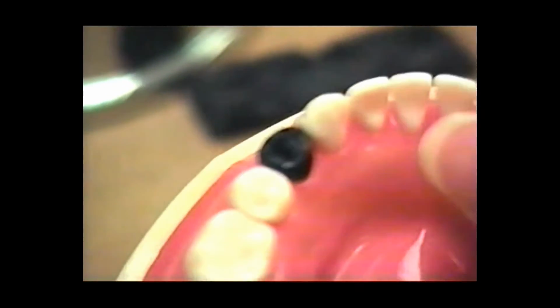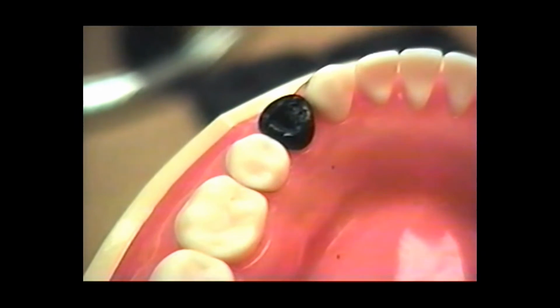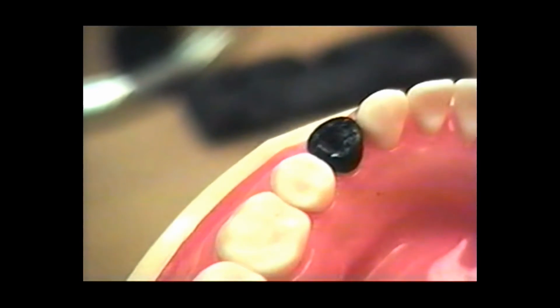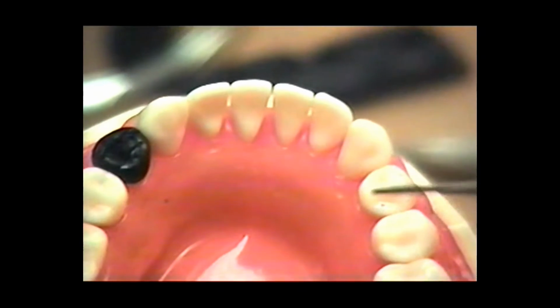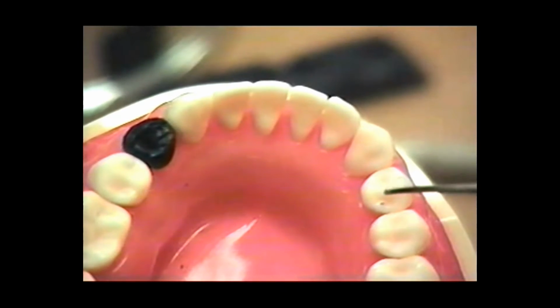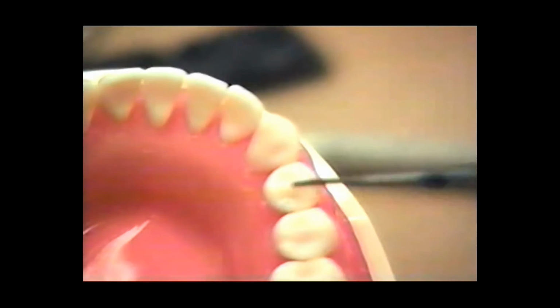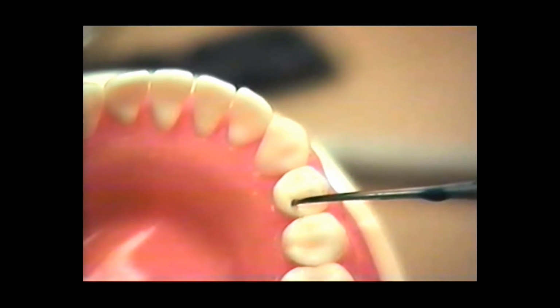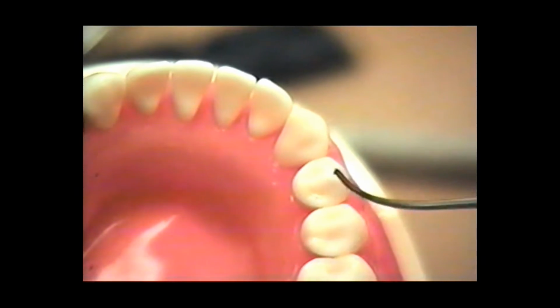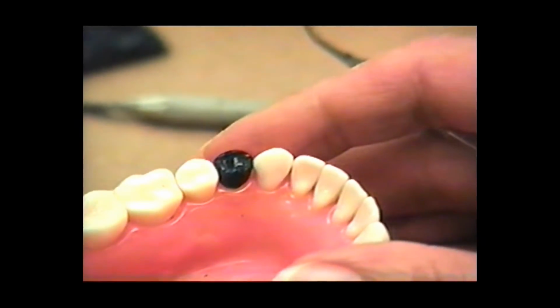That part's kind of the fun part. We know that we've got our cusps pretty much where we want them to be, so now is the time to go ahead and do some occlusal anatomy. And this is when I might look at the contralateral tooth, the tooth on the other side, and I'm going to look at things like, okay, this triangular ridge comes down and it's more bulky toward the distal. I've got a central groove. I've got pretty prominent mesial and distal fossae. I've got a groove pattern that looks like this. And so I'm going to carve in a groove pattern that looks a lot like the one that's on this tooth here.